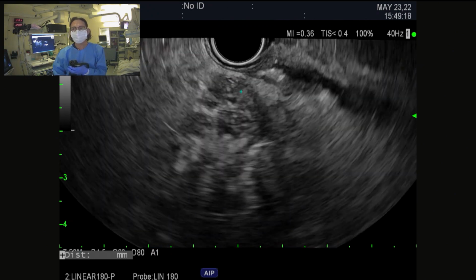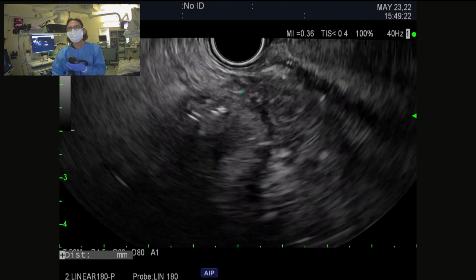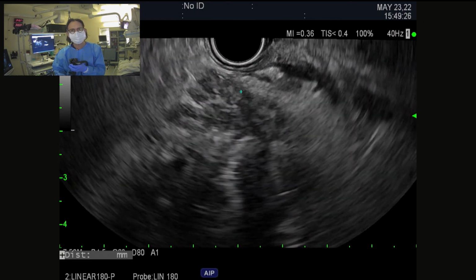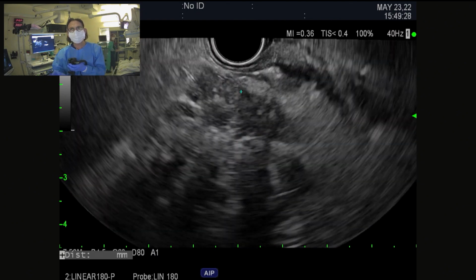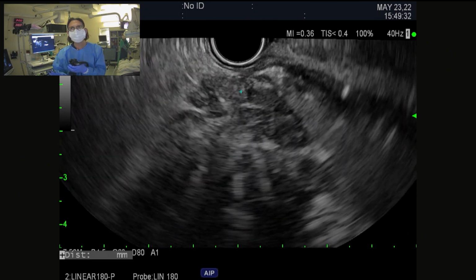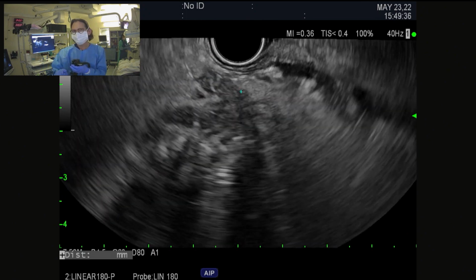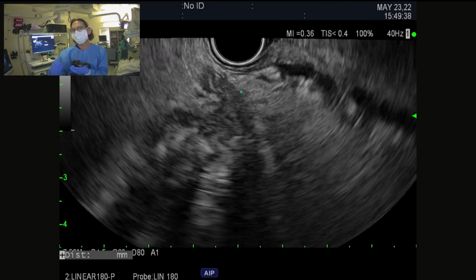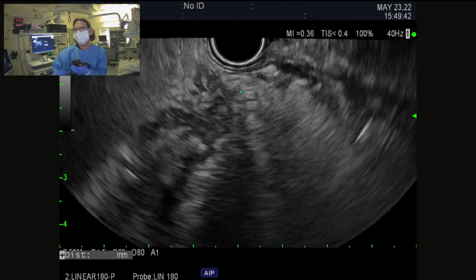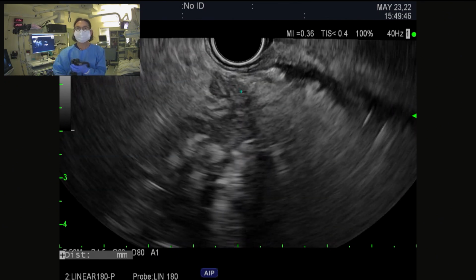He's not getting better, and because he has a percutaneous drain in, my proposal is that we're going to put a LAMS in here, a large one, and we will create a closed circuit so that we're infusing the percutaneous drain and flushing out through the transgastric LAMS.